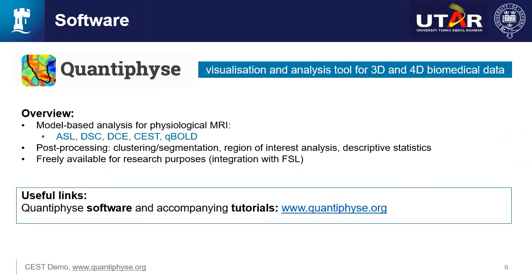So to perform model-based analysis, as well as the other steps within the CEST data analysis pipeline, which I will describe next, we can make use of Quantiphyse, which is a visualization and analysis tool for 3D and 4D biomedical data.